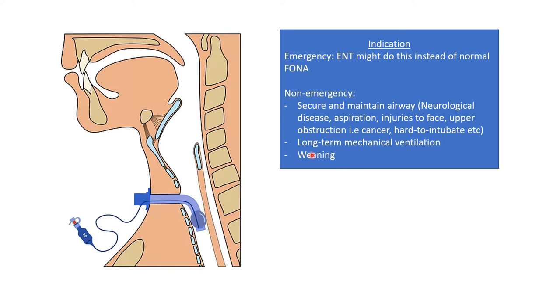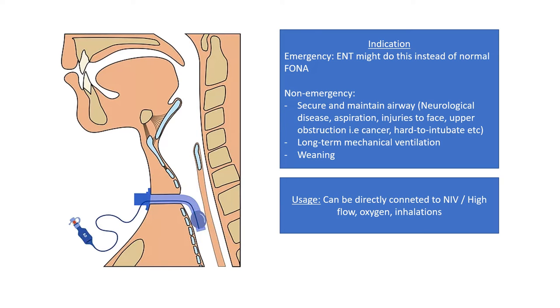And it's also used for weaning when you want to get patients off the ventilator. It's important to know that once the patient comes in, if it's cuffed, you can connect this directly to inhalations for asthma medication, for BiPAP or NIV, for high flow oxygen, for all the devices that you use up here, you can use here directly.